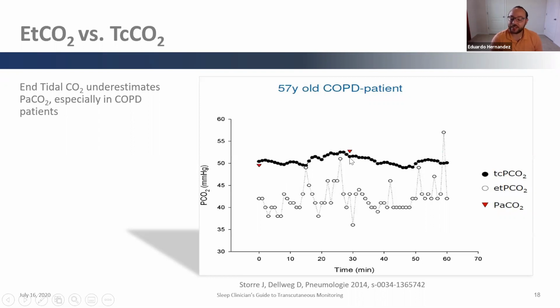The transcutaneous CO2 levels were most in line with the arterial CO2 levels, with minimal differentiation between the two, versus the end-tidal, where you can see it was jumping up and down during those 70 minutes, how it would get close, how it would go back down. Maybe the patient was mouth breathing, maybe the cannula got loose, whatever interface you're using to measure end-tidal, it looks like it wasn't as consistent as the transcutaneous monitoring. It means that it could severely underestimate these CO2 values.